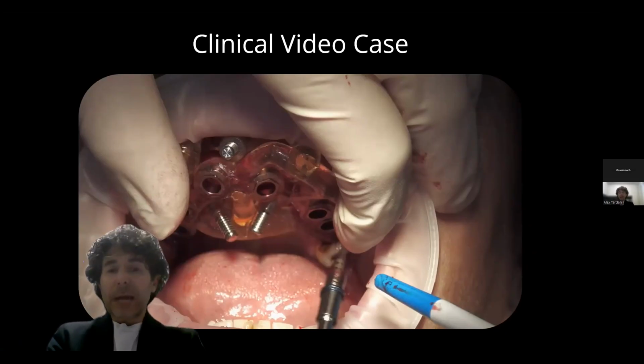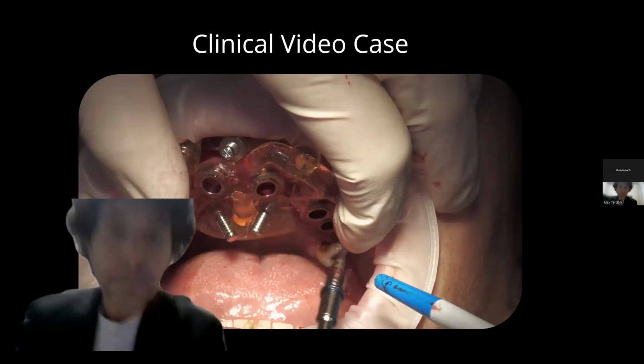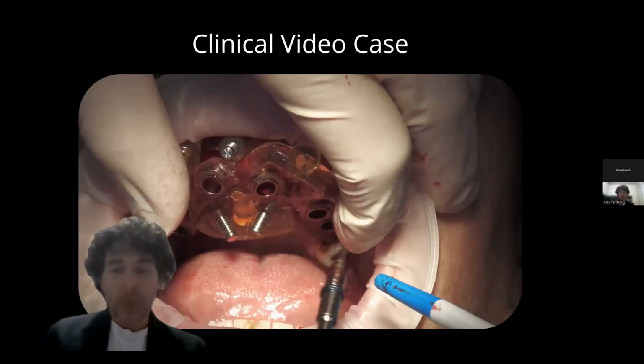complain. On the other hand, we must be careful that blood residue doesn't build up inside our sleeves, a layer that will make it harder to pass through, so using saline is always recommended. To lightly rinse our sleeves, thus allowing a smoother gliding of our instrument inside the sleeve itself.